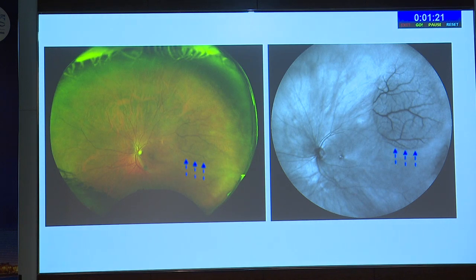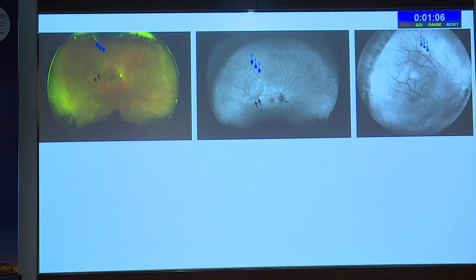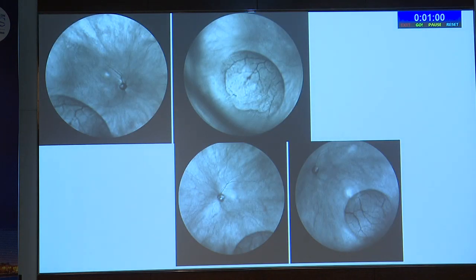Now you can see a wide field fundus photograph. This is a patient of retinoschisis, and this infrared technology can highlight this elevated lesion much better. So you can see the true extent of the bulla much better with the infrared technology, and it has been better than the autofluorescence. You can delineate this elevated lesion, and it has been one of the suggested modalities of documenting the progression of schisis, infrared images. It is more sensitive than the fundus photography.